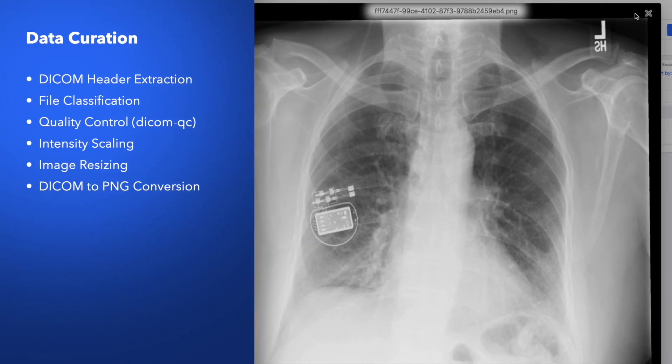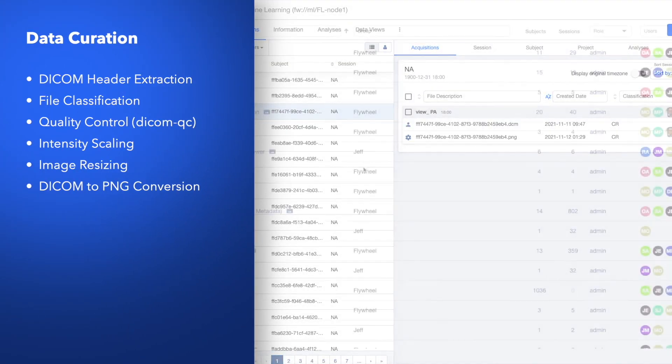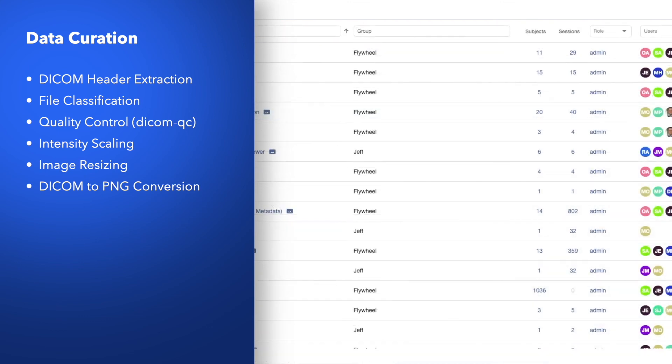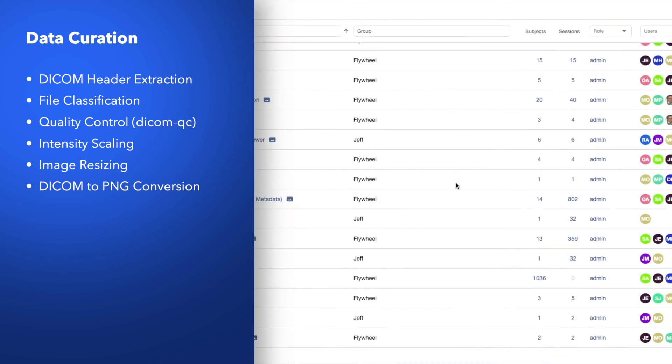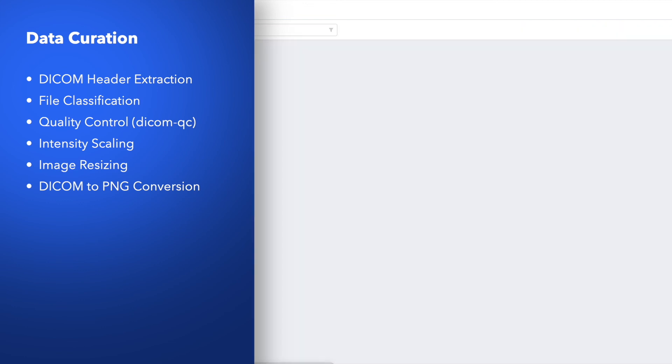Using gears, each dataset had its metadata extracted, was validated with QC, we automatically adjusted intensity scaling, performed resizing, and finally converted each image to PNG in preparation for machine learning.